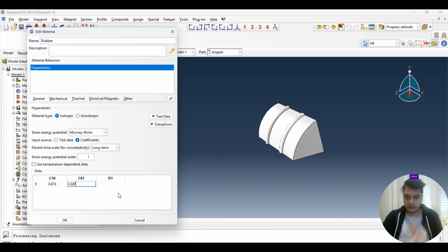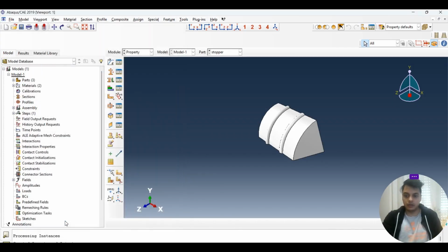these types of hyperelastic material have different theory, and one has to really understand this theory, so that we know what the different parameters being added here are, and what the constitutive laws and equations are that define this. For example, if we talk about soft tissue biomimicry, then we have the Ogden model. So we have to understand all these parameters that we put, like alpha 1, alpha 2, and even compressibility factors. So everything is there.